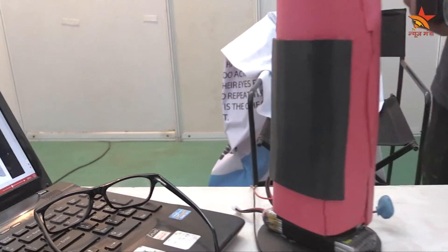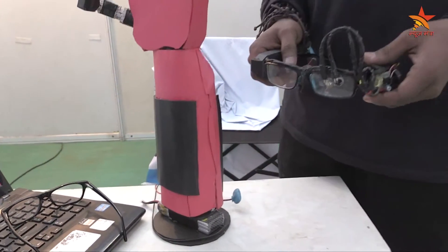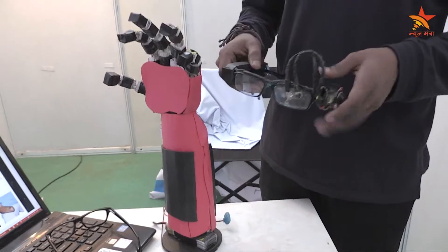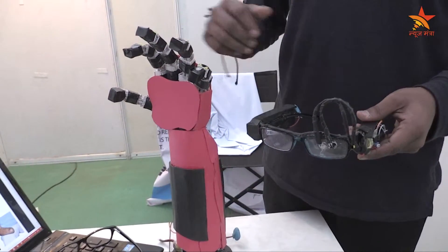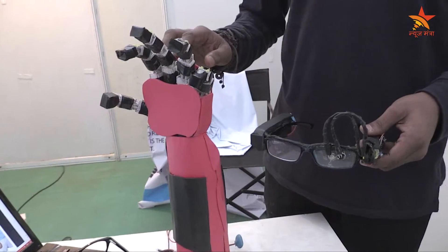They are able to move the hand in whatever direction they want, but they cannot actually pick an object and place it somewhere. This bionic hand can help them to pick and place objects, and it has two degrees of freedom.